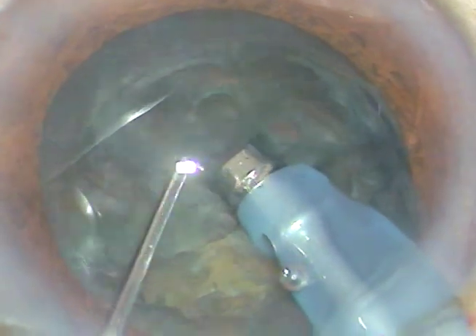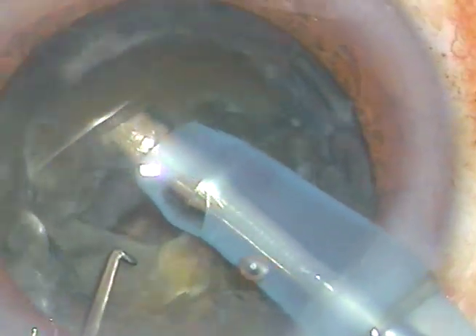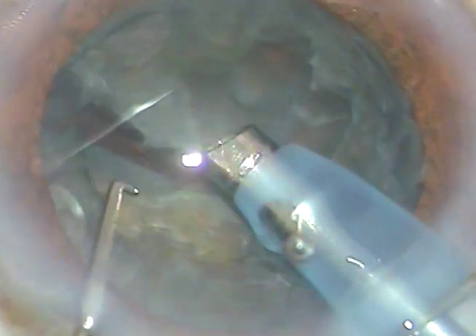Since the cataract is very soft, I cannot hold it — I can only make a pit and stay there. I could not hold it and could not do anything with this piece, so I have to leave it and come to the opposite side. I just support this hemi-nucleus and chop it, dividing the hemi-nucleus into two pieces. Each nuclear piece is then emulsified and taken out.